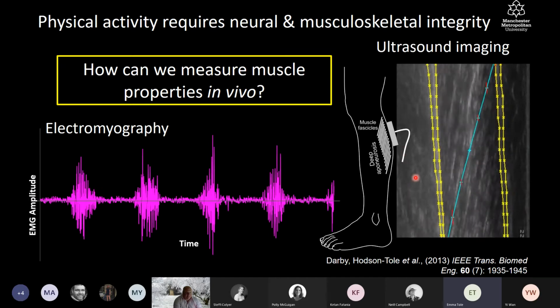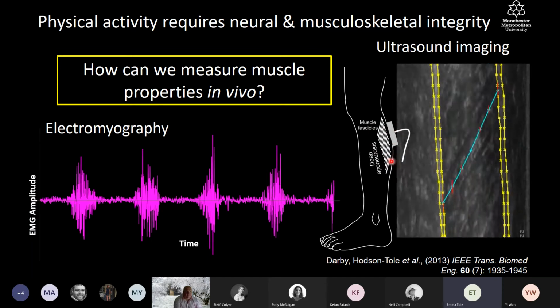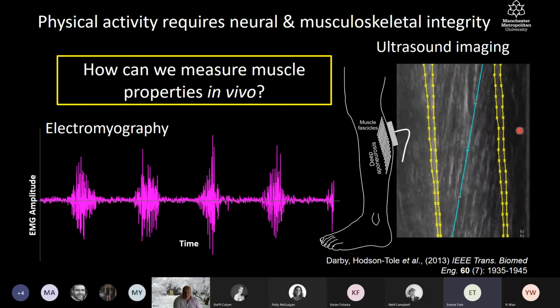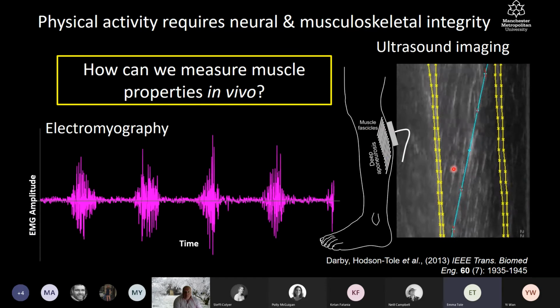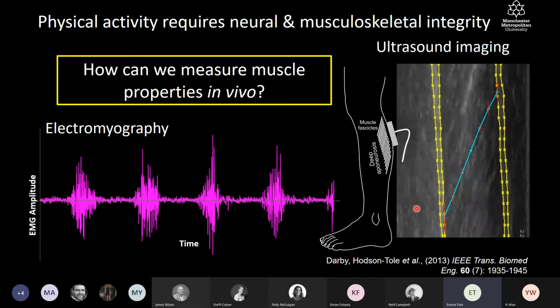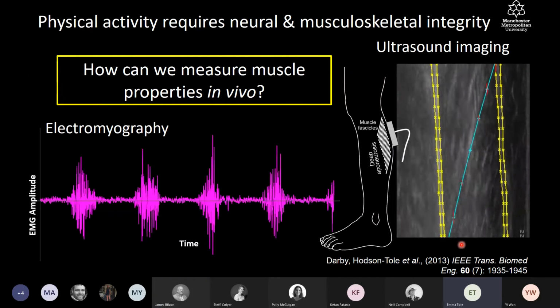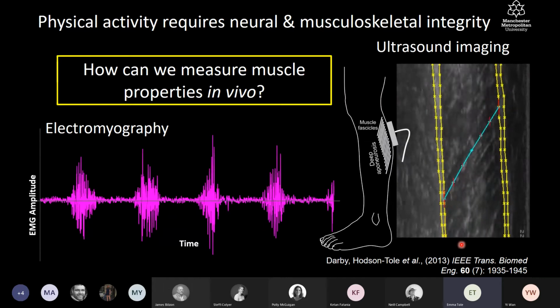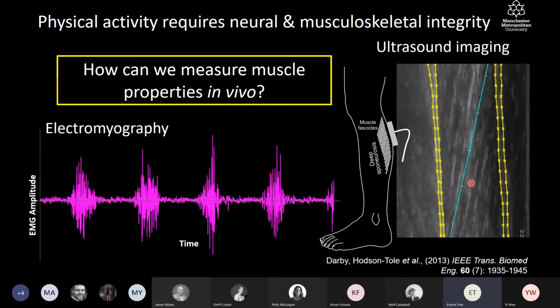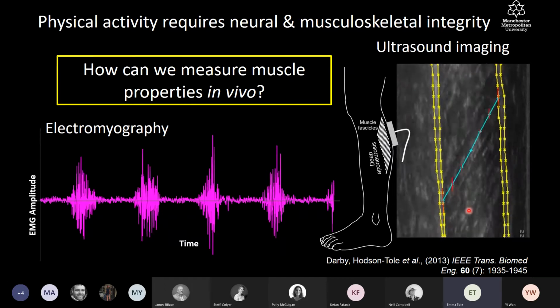But we have here an ultrasound image recording from the medial gastrocnemius muscle. This is located in the calf region of the lower leg. And we can see on the image here, the skin surface is along this boundary here. The muscle itself is situated in the central portion here, and then we've got some deeper muscles shown here as well. And how the muscle moves and changes shape has been the focus of quite a lot of work, because it relates to that force production, that force translation, if you like. So in the biomechanics world, we've been really interested in capturing the length and the shape change of the fibres or the muscle fascicles that reside in the muscle belly. So in this region here.